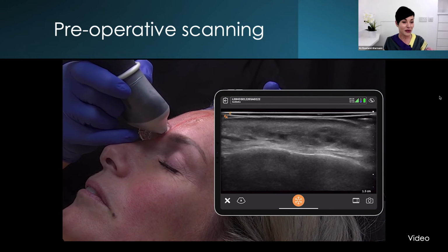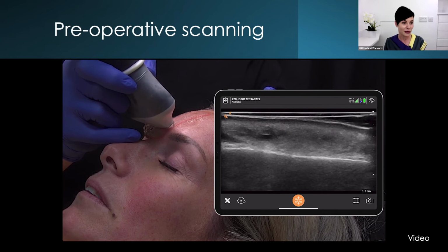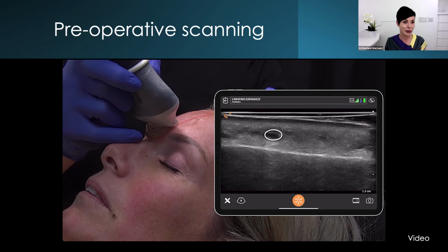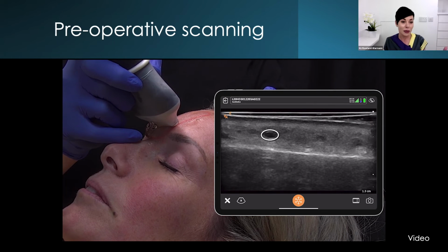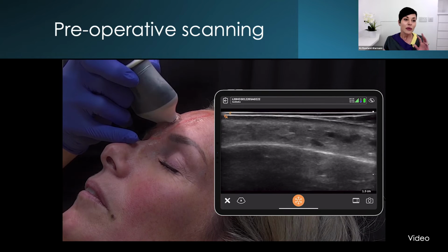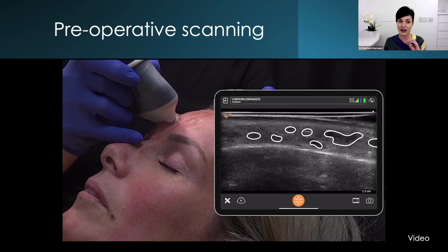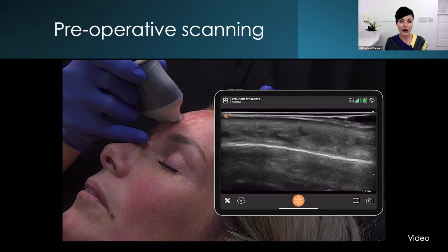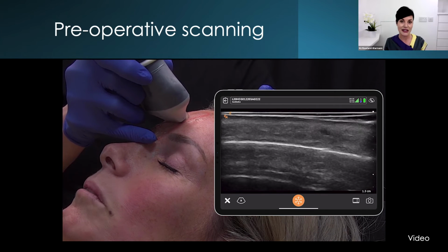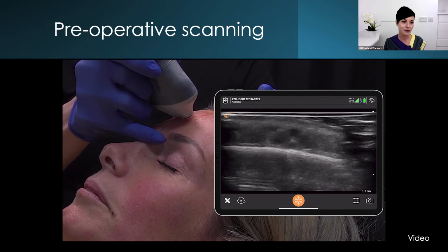So let's do some more scanning, first in B mode. I've marked out in red pen on the skin the swollen and tender area to reference my scanning. Immediately, we can see round anechoic deposits that we suspect to be filler. Could be a vessel, they come up anechoic too, but it's a bit big for that. Moving a bit more cranially in the forehead, we can see the extent of the filler, and there is a lot. And further up still, there are more deposits at varying depths, and they are sizable. They're spread over much of the central part of the forehead.